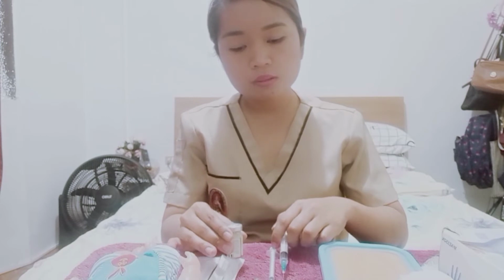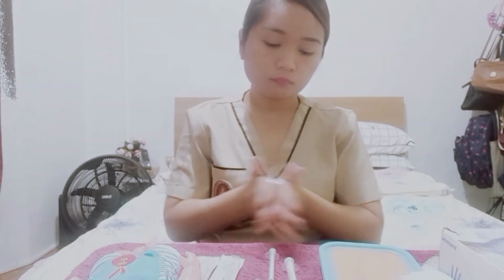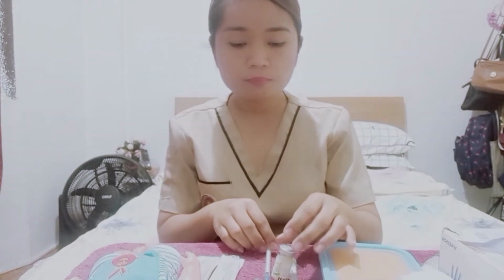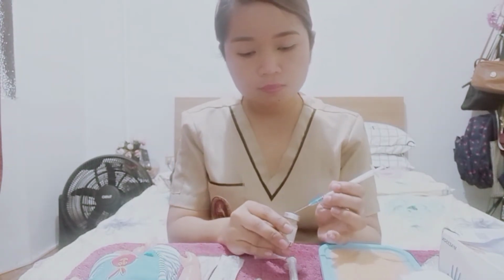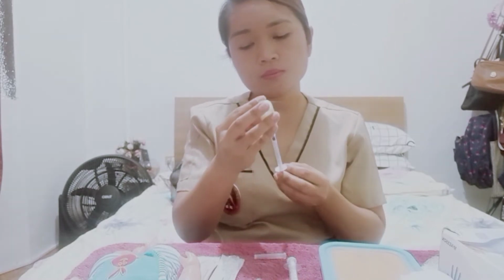So after that, you make sure that we mix. After mixing it, we get the syringe. We draw the medication.